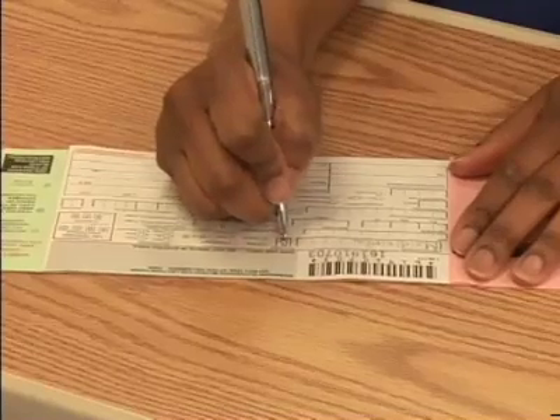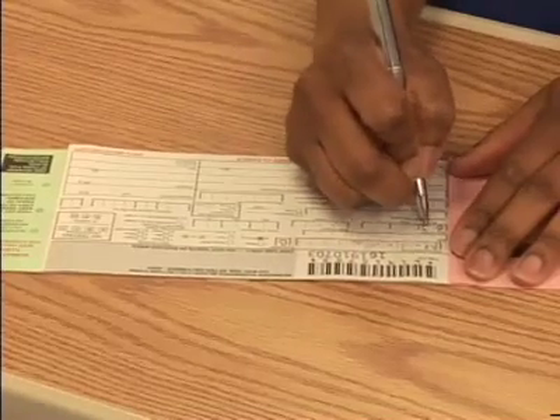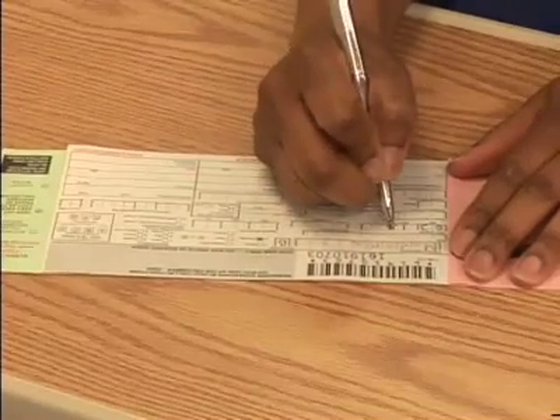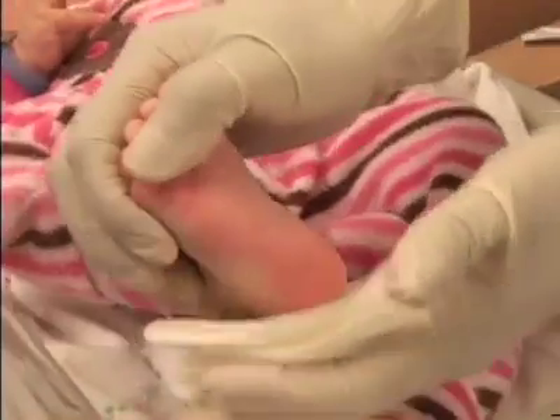Begin the procedure by identifying the infant according to your facility's procedures. You may then fill out the information on the newborn screening card. Warm the puncture site according to your facility's procedures. Wash or sanitize your hands and don gloves. If required, don a mask and gown.